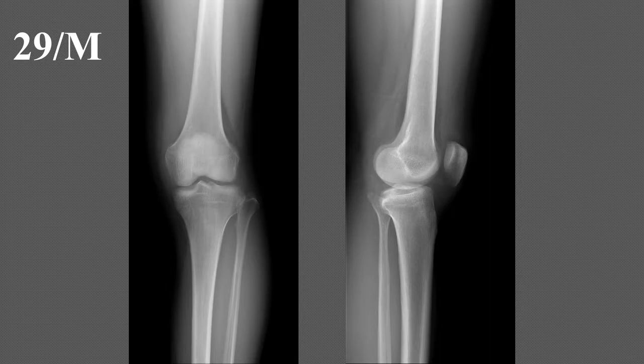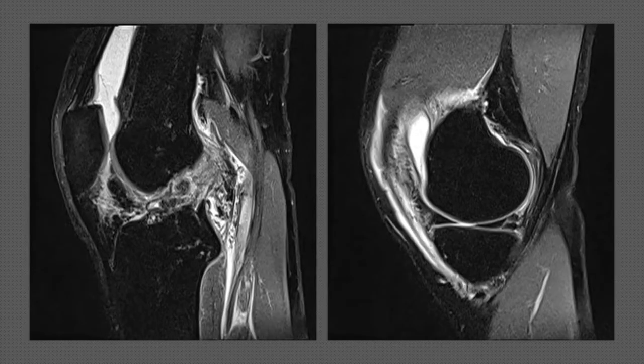A 29-year-old male visited the outpatient clinic for left knee pain after a fall from height during climbing. MRI revealed a complete ACL tear and complex meniscal tear.